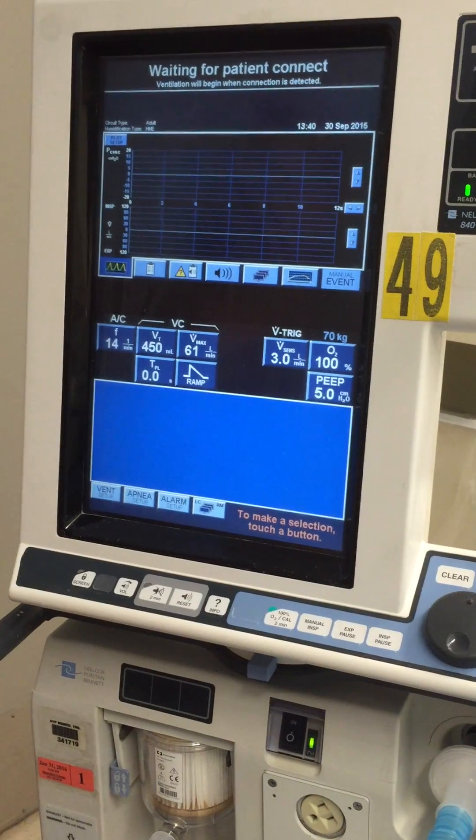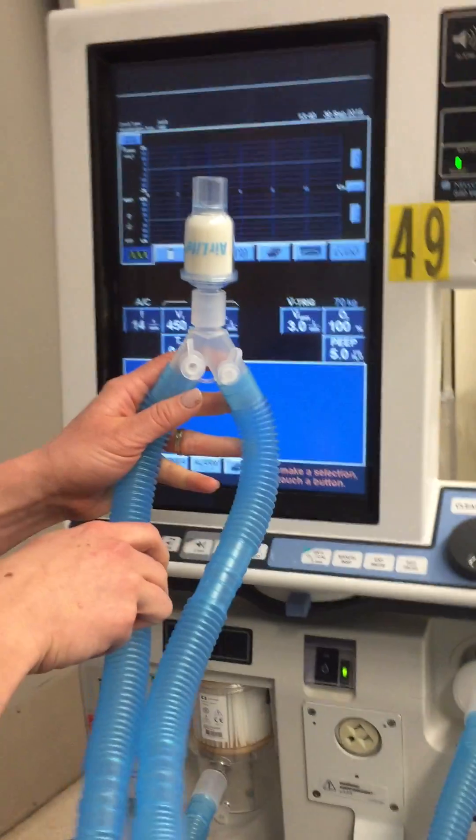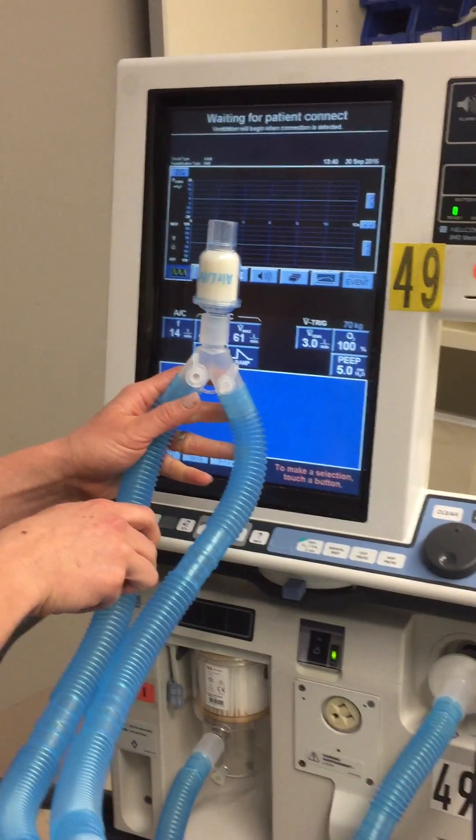After that, you're basically ready to connect this to your patient.